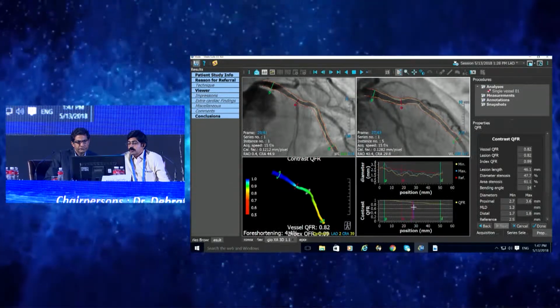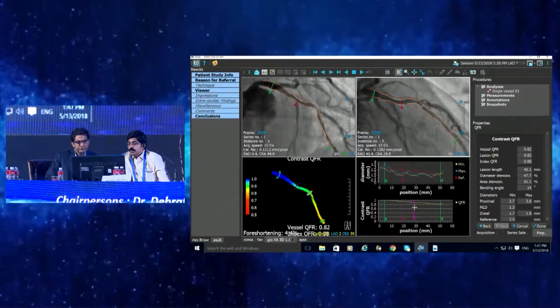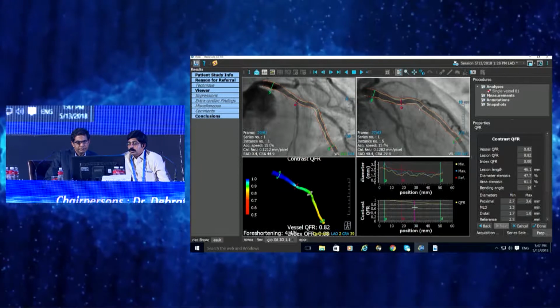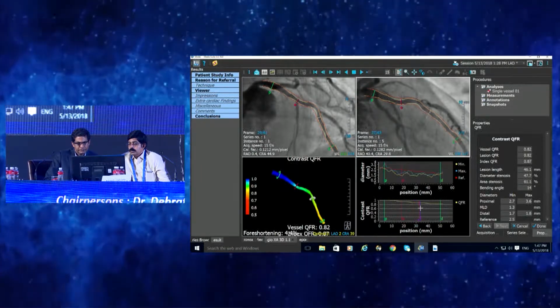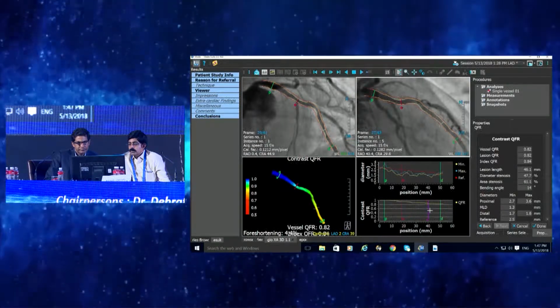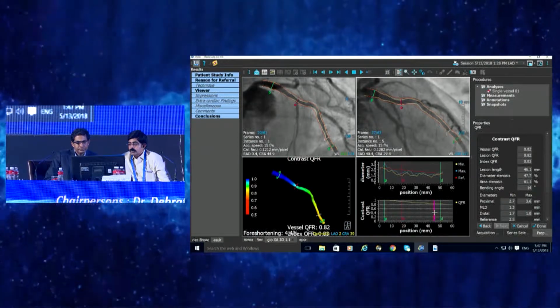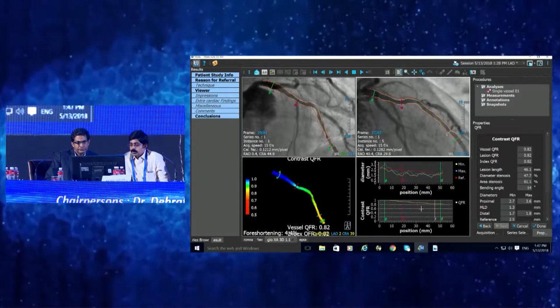The other point is the second lesion, where there is again a drop further. So the idea is you can't get away. Other thoughts we were having was whether to do it only from the diagonal to below, or treat the lesion separately. Now there is a drop even before the diagonal. It's imperative that we cover the lesion before the diagonal too. So that's how we thought, as we cover normal to normal, we should do entire lesion length coverage.